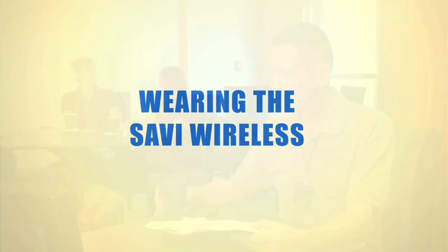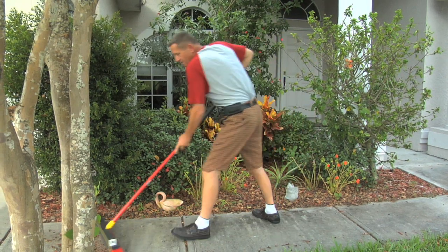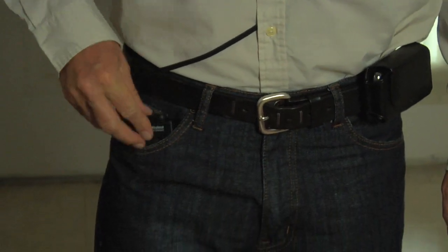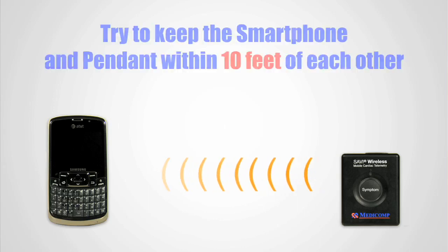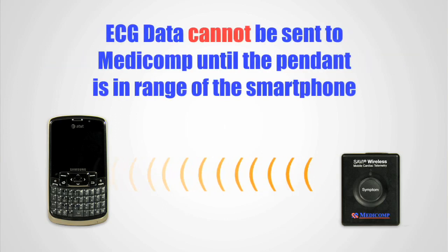Wearing the Savvy Wireless. It's important that you keep the Savvy Wireless hooked up to you at all times, and be sure the symptom button is easily and quickly accessible. Wear the Savvy Wireless pendant and smartphone where it's most convenient: on your waist using the belt clips, in a readily accessible pocket, or wearing the pendant around your neck using the lanyard provided. Try to keep the smartphone and pendant within 10 feet as much as possible. The pendant will continue to capture your ECG even if it's temporarily away from the smartphone, but it cannot be sent to Medicom until you're once again within range.